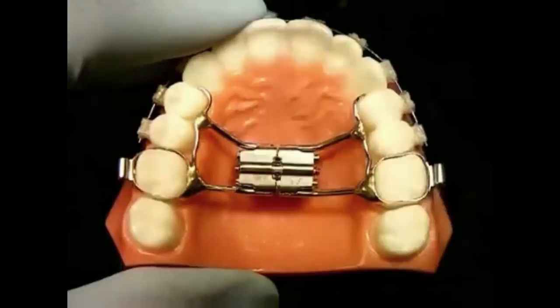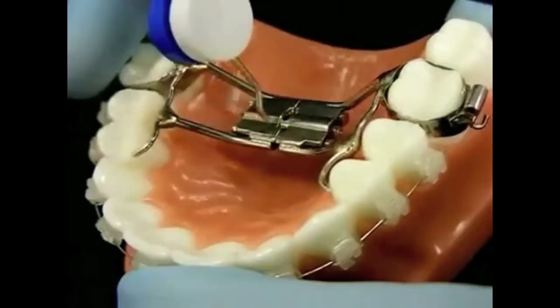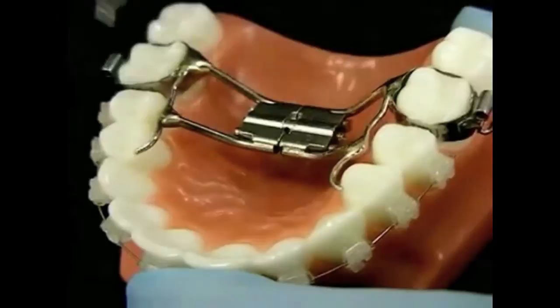Another mistake commonly made in activating the palatal expander is not turning the screw a full turn before removing it. If you do not turn the screw a full turn before removing it, you will not be able to access the second hole to activate the expander next time. If you accidentally remove the key before completing the full turn, simply place the key back in the first hole, turn the screw until you can see the second hole, then remove the key.